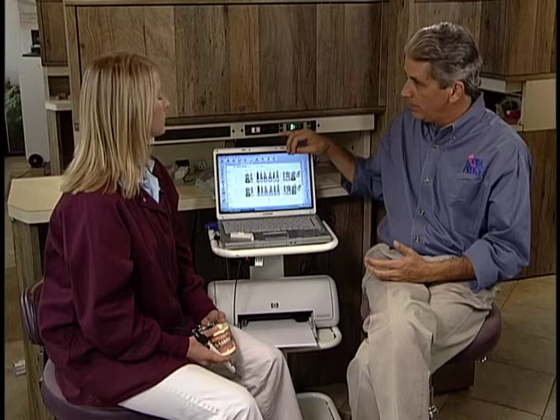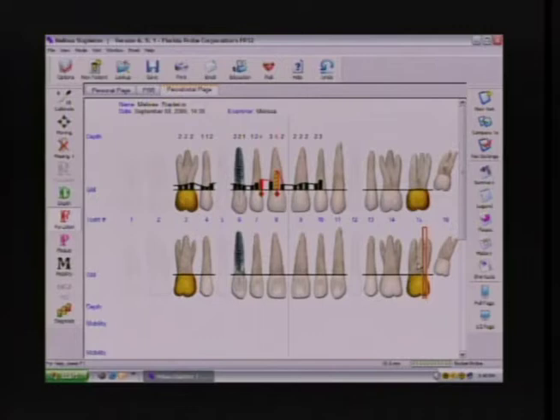Oh, we advanced beyond it onto the lingual. We have two choices. We can use the undo button because it recorded a 0, or we can go into the moving mode. Let's go to undo. We're on the buccal of 15. The software knows it needs a multi-rooted tooth. It knows 2 sites, buccal or lingual.